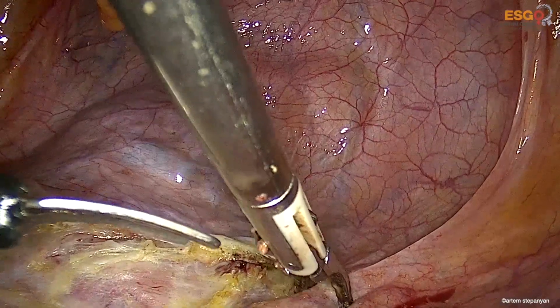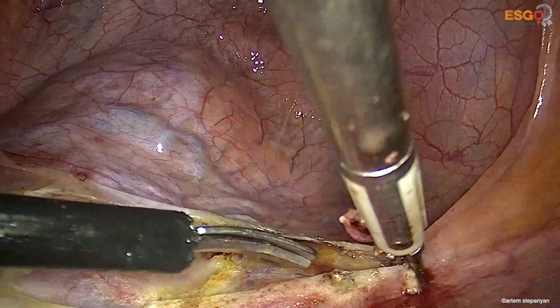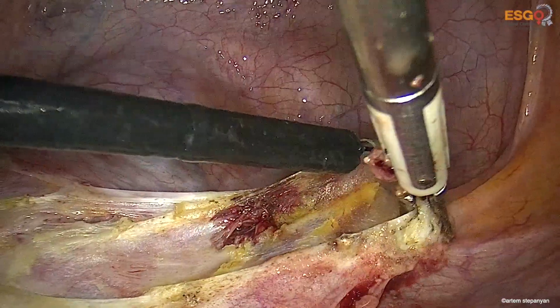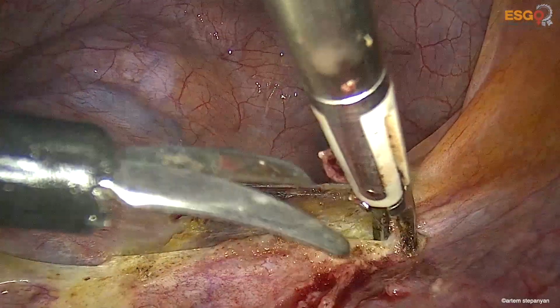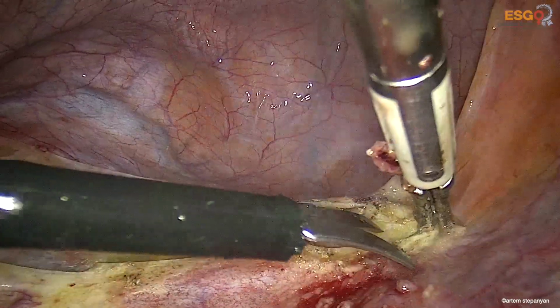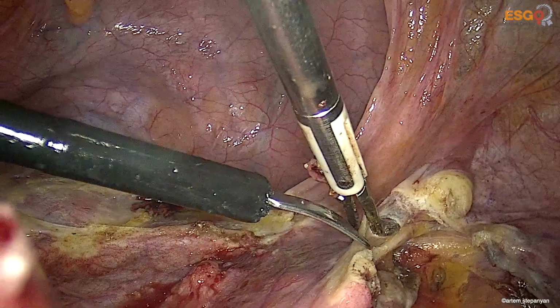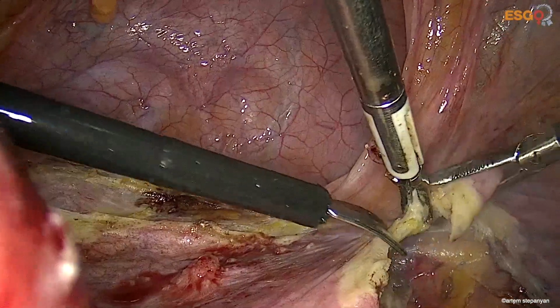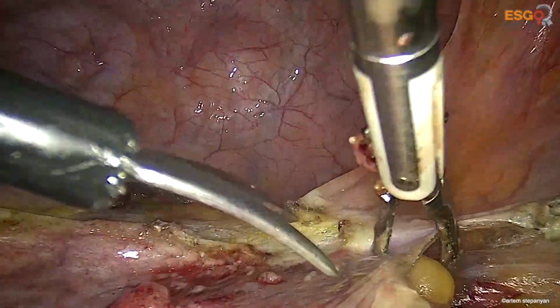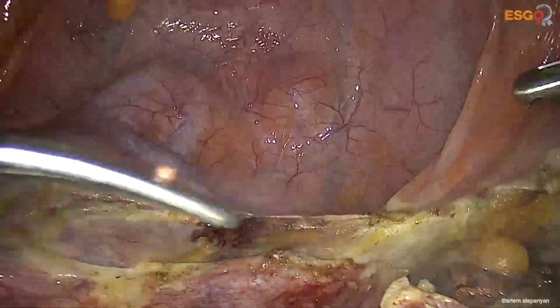We proceed our incision towards the round ligament, and here we see the implant is being included in the specimen to be removed. Okay.